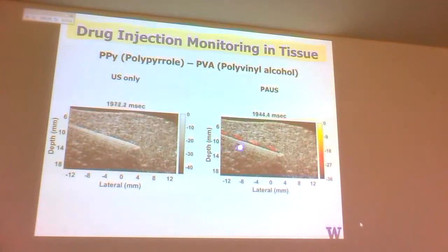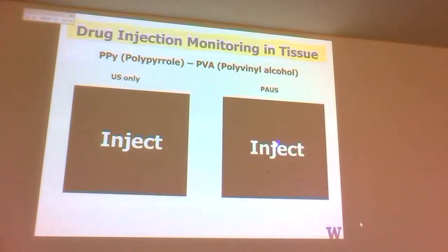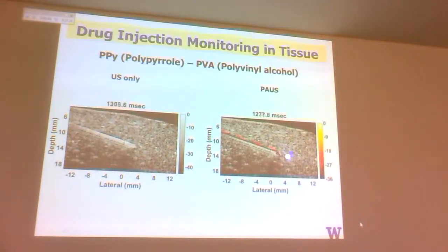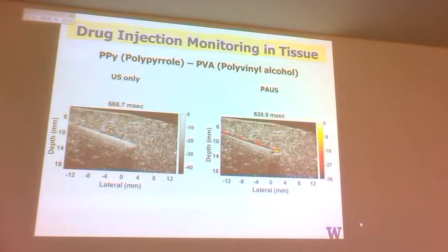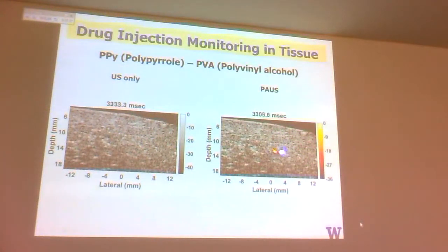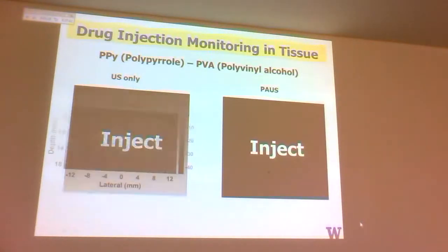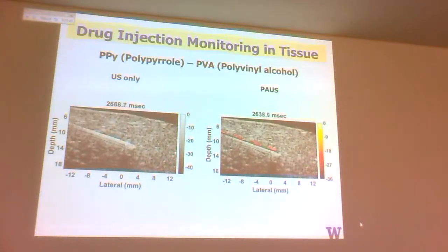So you now deliver it in there. You now deliver the cells. So let go. Inject. You're seeing the cells. Right? You pull the needle out. Come on, pull it out. Out it goes. And what are you imaging? The cells. I can come back tomorrow. I can come back in 2 days. I can look to see where the cells are, see if the cells are viable.